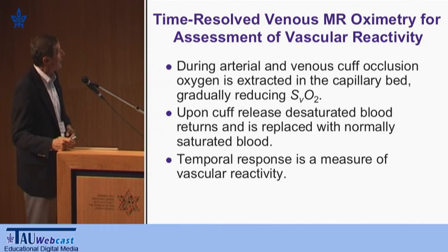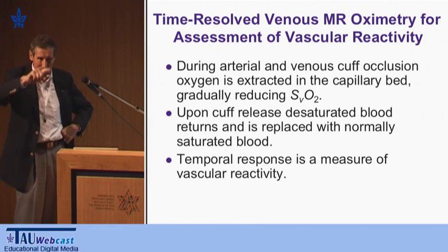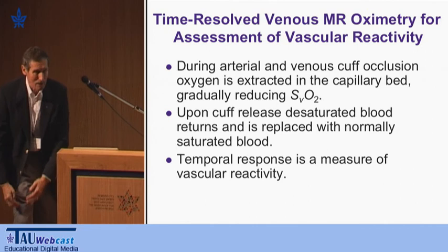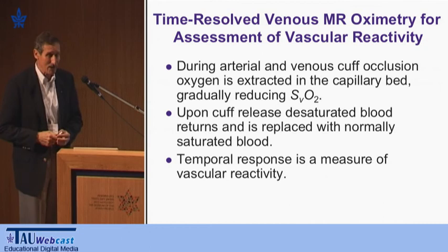But upon cuff release, the desaturated blood returns and gets replaced with the normally saturated blood. So we expect a dip as we monitor the oxygen saturation just slightly distal to the cuff. So this temporal response, we think, is a measure of vascular reactivity, and we have actually applied this to patients with peripheral arterial disease, and we see dramatic differences.